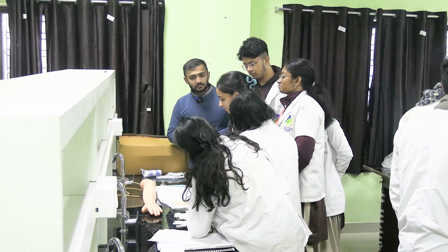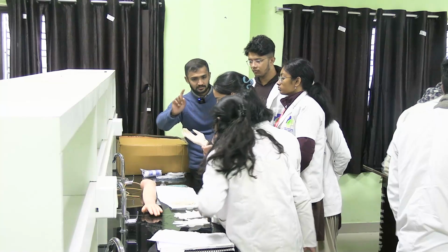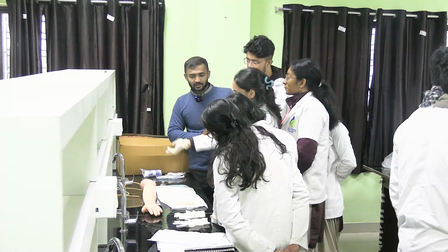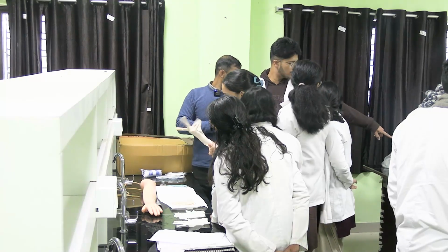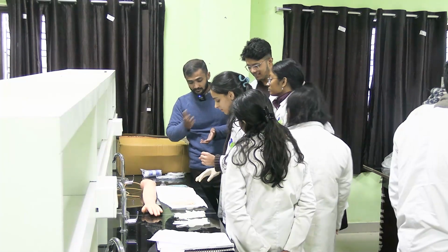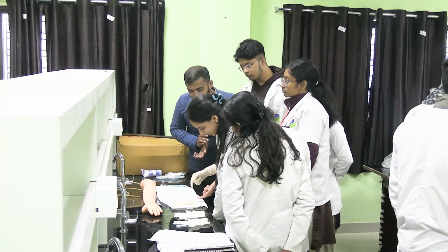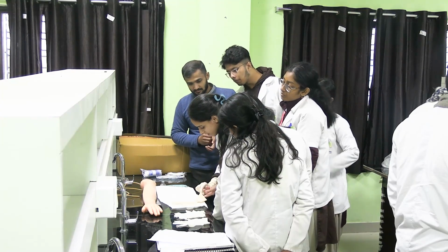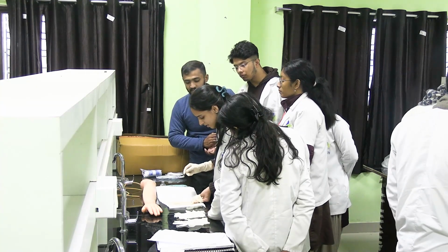Which gloves will you be wearing when doing such a procedure? Only surgical gloves, not these loose gloves. What is the name of these gloves? These are for regular use. There is a box, but no particular name. This is a brand, I think. Nitrile. Okay, then what about the left? Which part is sterile? This one is sterile. Inside is not sterile, so you cannot touch the inner part with the sterile hand. So which part will you be touching? How will you introduce?